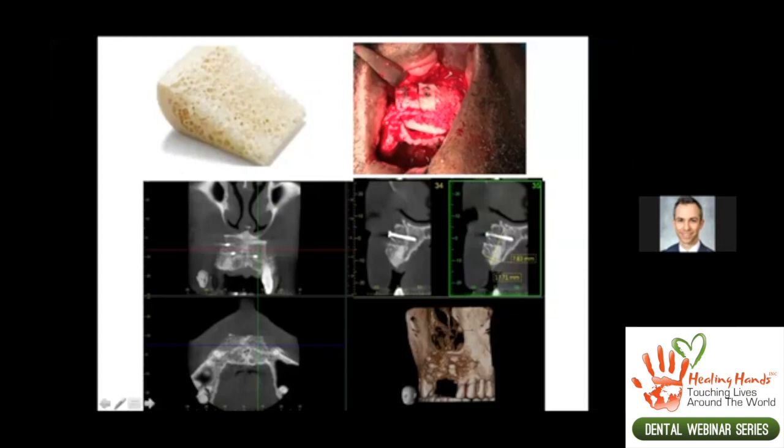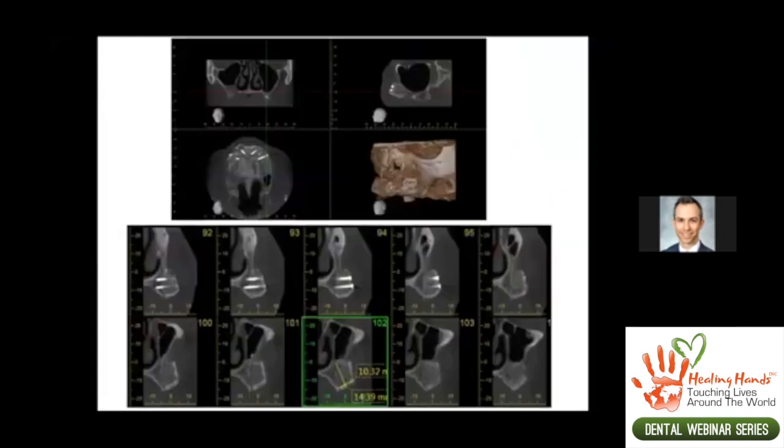Sometimes I'll combine block grafts and adjacent guided tissue regeneration, and frequently when I place a block graft, I will support it with some particulate bone to create a broader base, which will decrease the amount of stress that the soft tissue is exerting on the graft and help prevent excessive resorption of the graft during the healing process. So you can see here's an example of a patient with 4 block grafts. And you can see how thick and generous these ridges are.